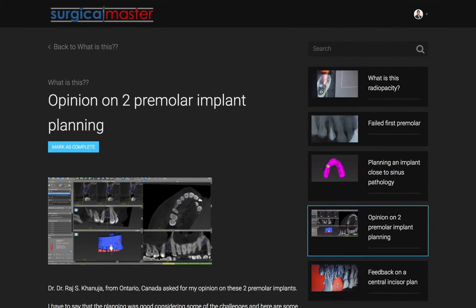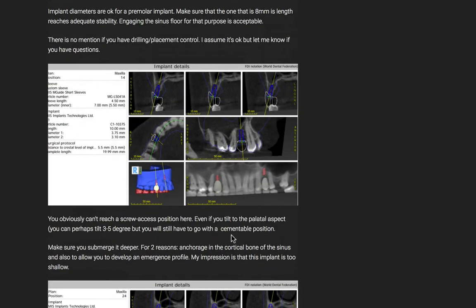sent me a case where he planned two implants in the upper premolar position. And he did a good job considering also the compromised sites. There were some issues with bone height and bone quality, and I gave him some feedback here on the platform that I wanted to share with you as well.